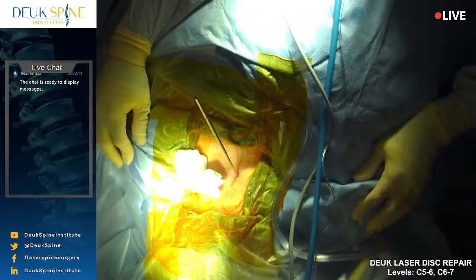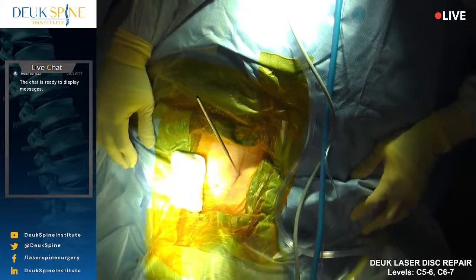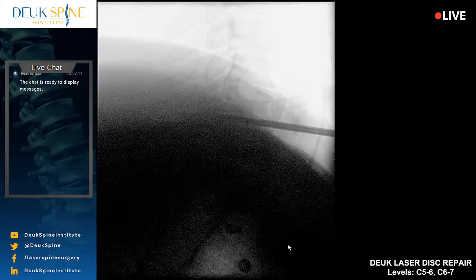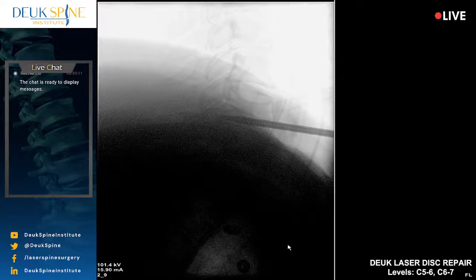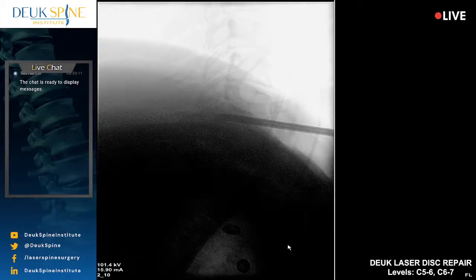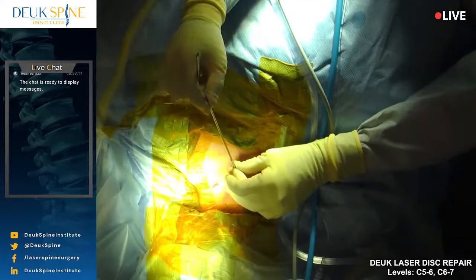Yeah, this is the last time we'll need it, but I do need to advance the tube. I could feel it going in. I'm ready. Beautiful. You guys are doing amazing. Shot. I want to watch the end of my dilator to make sure it doesn't go in any further. I'm advancing my tube through the disc. This is perfect. Shot. Just about there. And shot. We're there. All right. Relax, everybody. So we are now at the back of the disc at C6-7, the bottom disc in the spine.